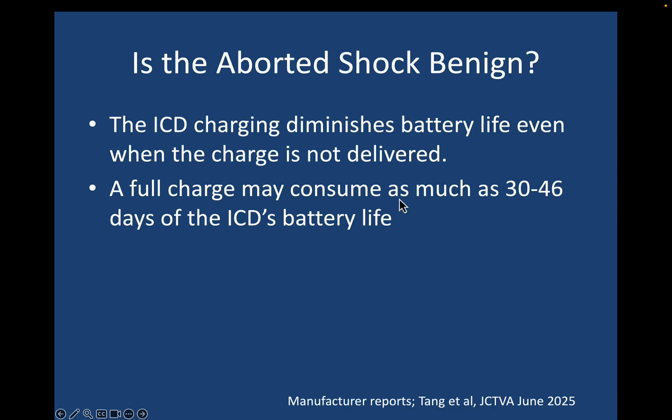And so the question is, is this benign? And the answer is no. The ICD charging diminishes battery life even when the charge is not delivered. A full charge may consume as much as 30 to 46 days of the ICD's battery life.